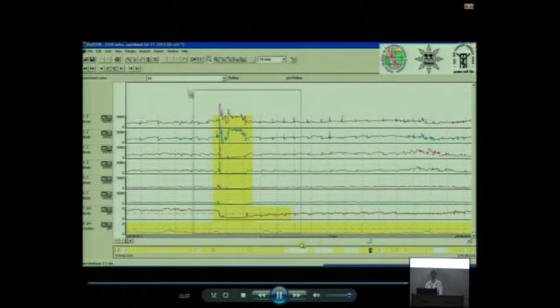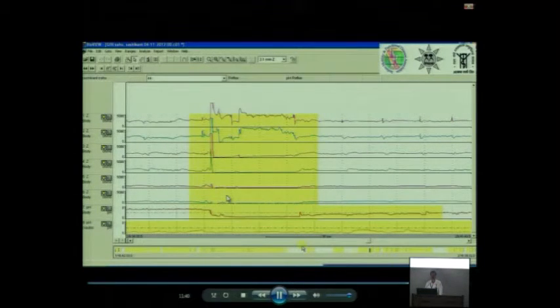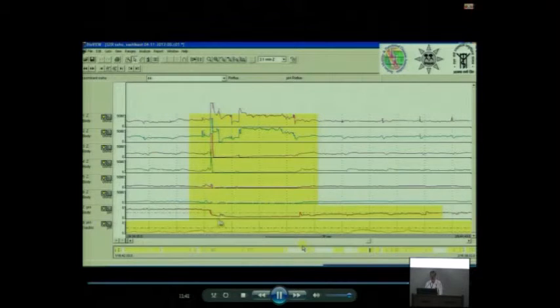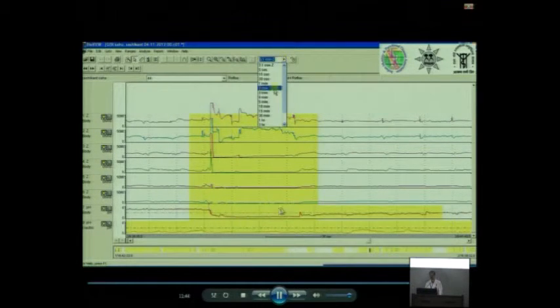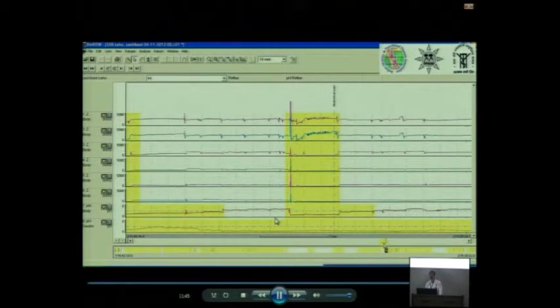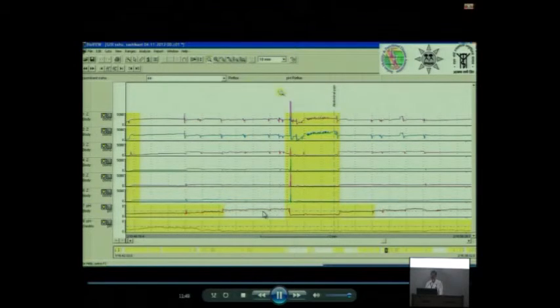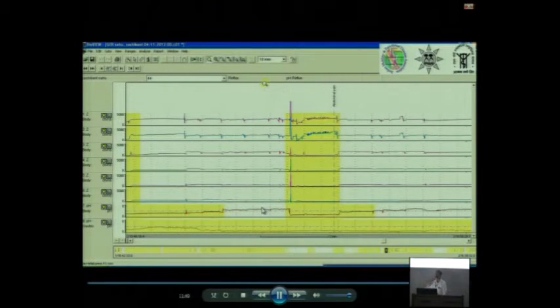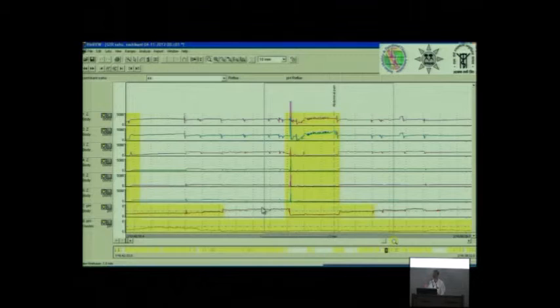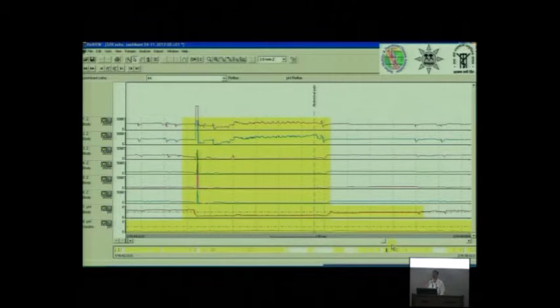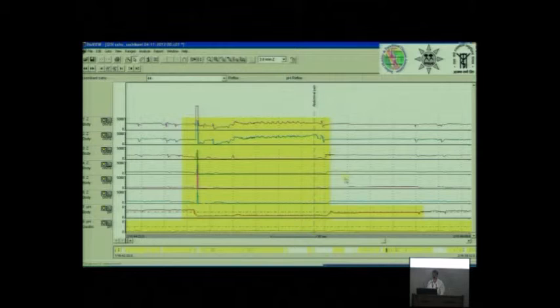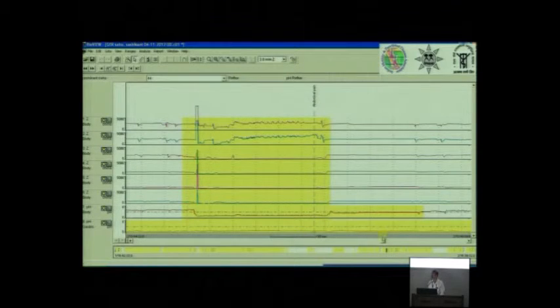Look at this, here again pH has dropped down, impedance has dropped down, and the patient has clicked on heartburn. This is a mixed reflux. You see some gas, but much of it is acid or liquid, and the liquid is again acidic. You can see it is a long duration reflux, at least 30 seconds. This duration of reflux is determined by esophageal acid clearance. Esophageal acid clearance occurs because of salivation, which we call as water brash, and second is esophageal contraction which pushes the acid back into the stomach.